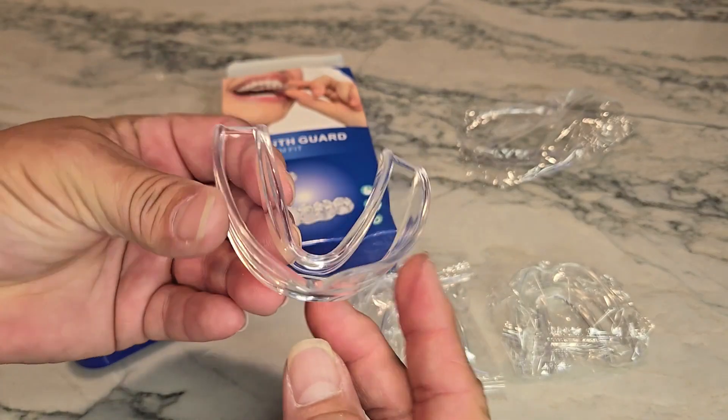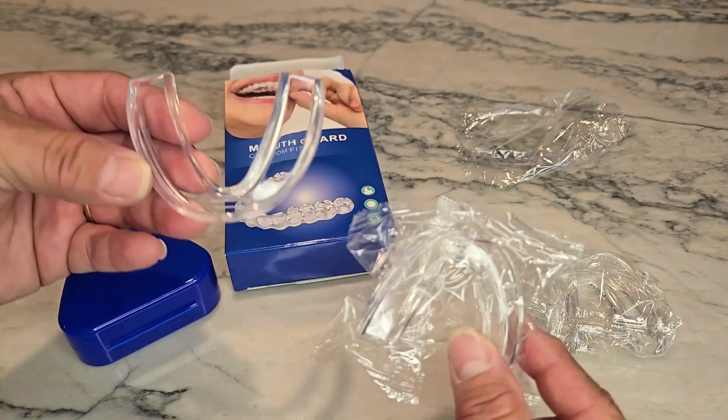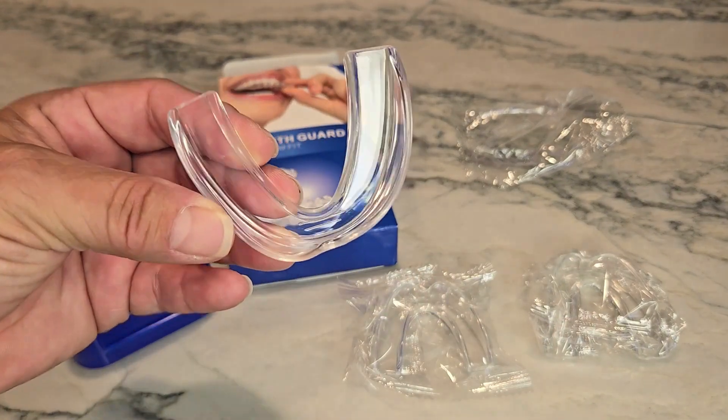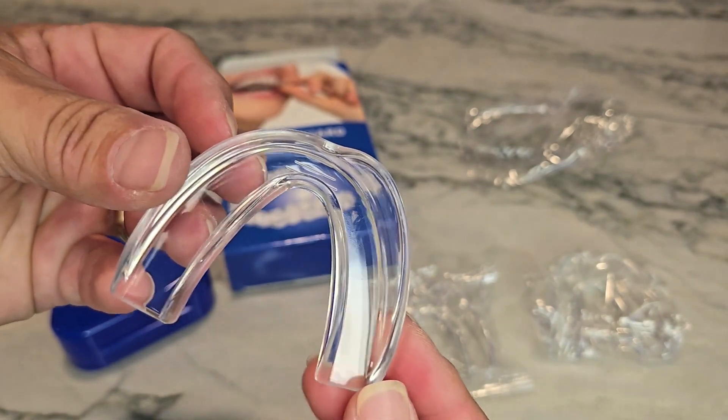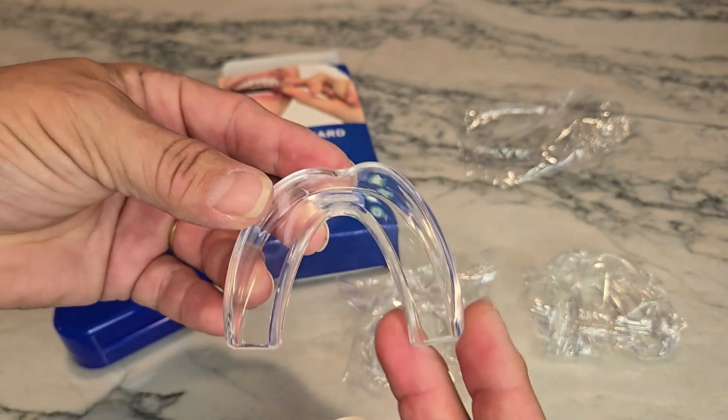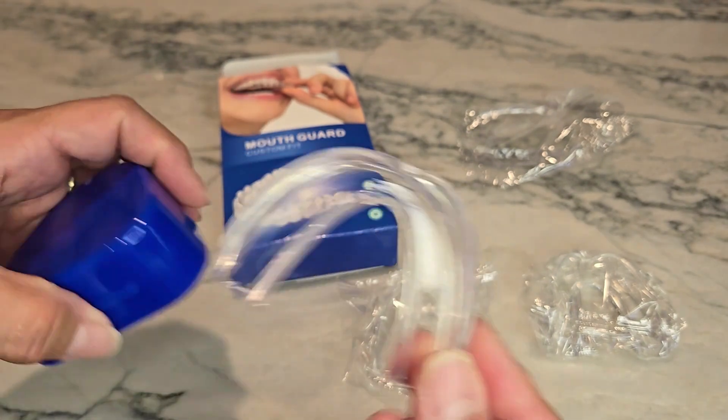Most mouth guards are extremely thick. This is the large size, and it came with two small ones as well as two large ones. You can see how thick this is — this is basically just the mold. What you'll do is dip it in extremely hot water, it'll get very soft and allow you to shape it into place.